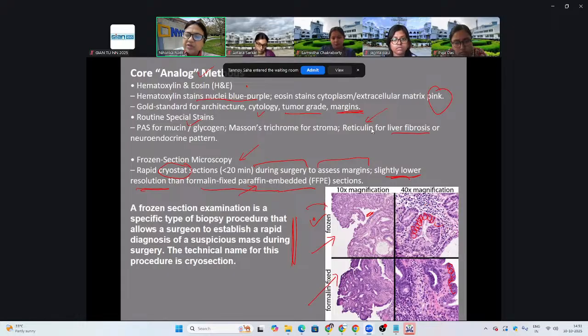But in those that don't, I don't have a record of this one, but this looks like all nuclei, with very little cytoplasm, just nuclei, nuclei, nuclei. So when you have just nuclei and very little pink, those are probably some of your tumor cells. Whereas here they look fairly good. They are pink and purple, pink and purple.